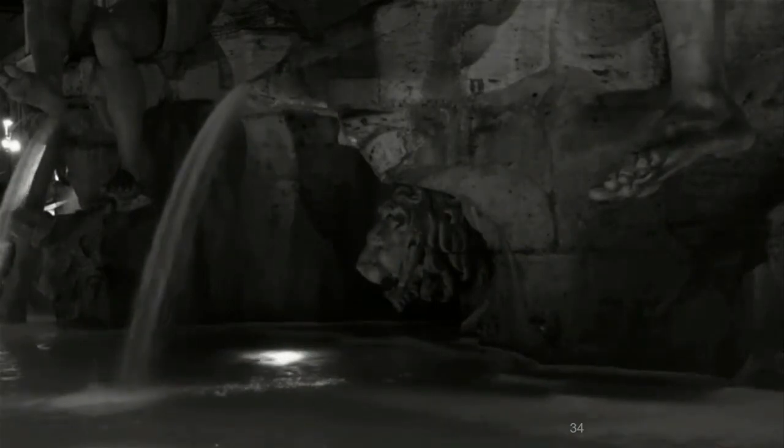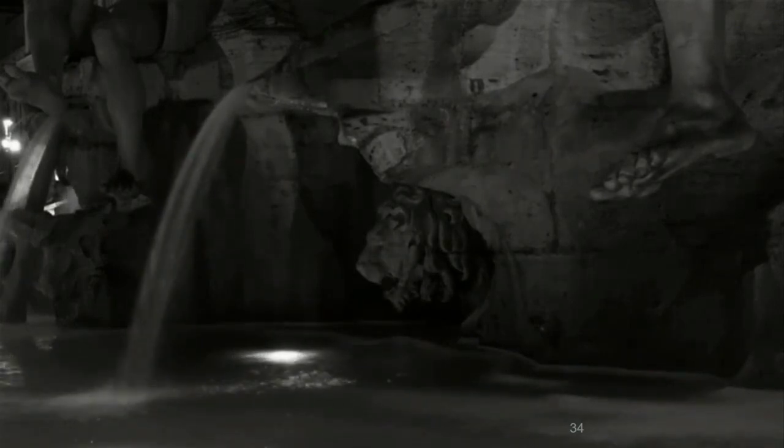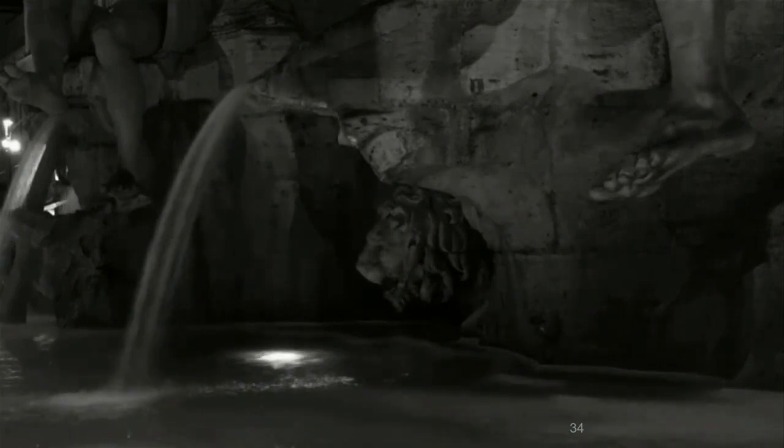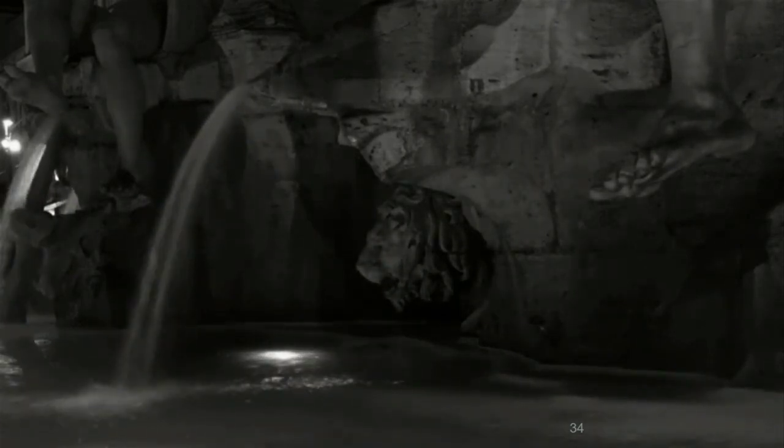So the light passes through here and picks up this movement, but the shadow of the light passes further and picks up the movement of the shadow of the erythrocytes. For the subtractive algorithm, the two are the same. It just says movement. It doesn't make a difference between movement of shadows and movement of erythrocytes. And that means that you'll pick up this over here, which means that you get this flickering over there, and when you sum it, you get this projection artifact here.